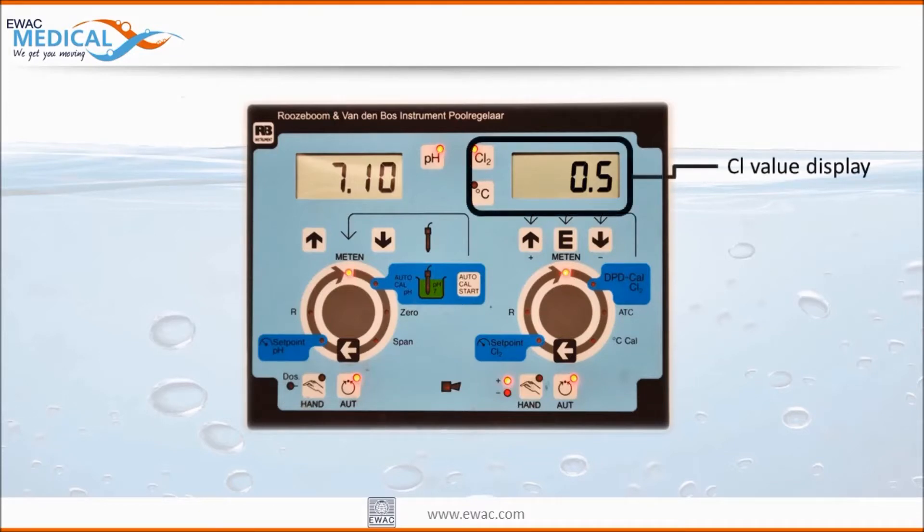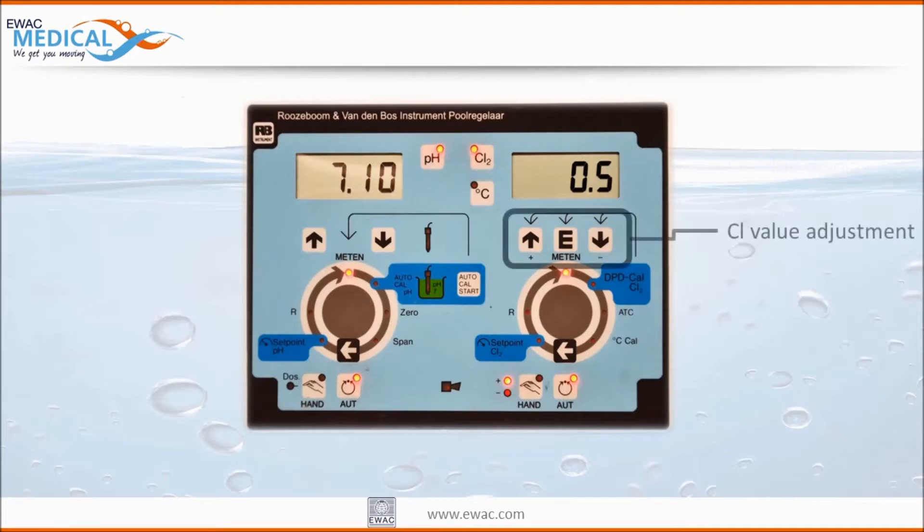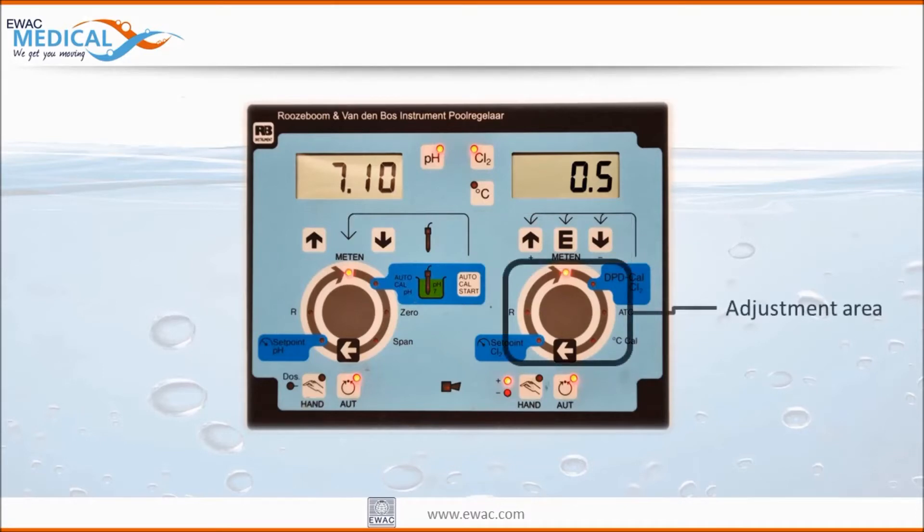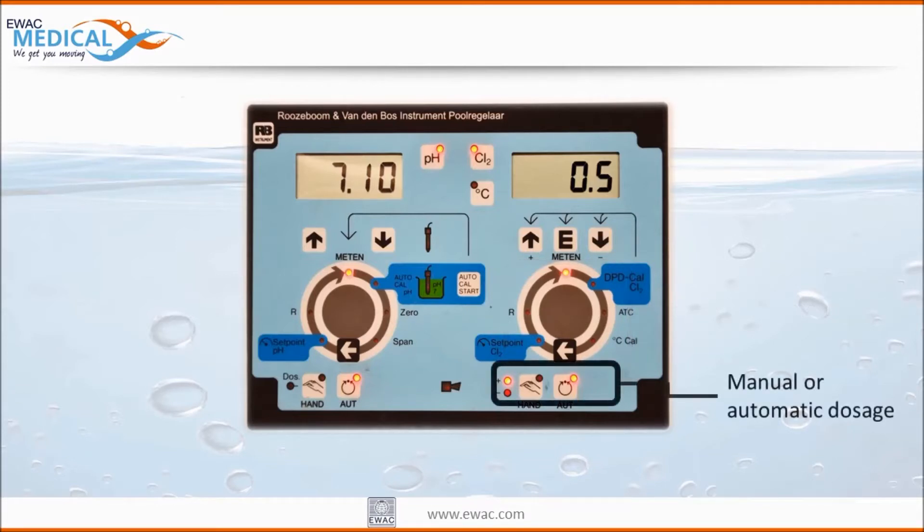On the upper right side the measured chlorine value is displayed. With the keys below it the settings and calibration can be changed. And again below it we find the adjustment area for setting the desired value and calibration. And again with the buttons below it we can switch between automatic and manual dosing of chlorine. This alarm LED will light when there's too much deviation.